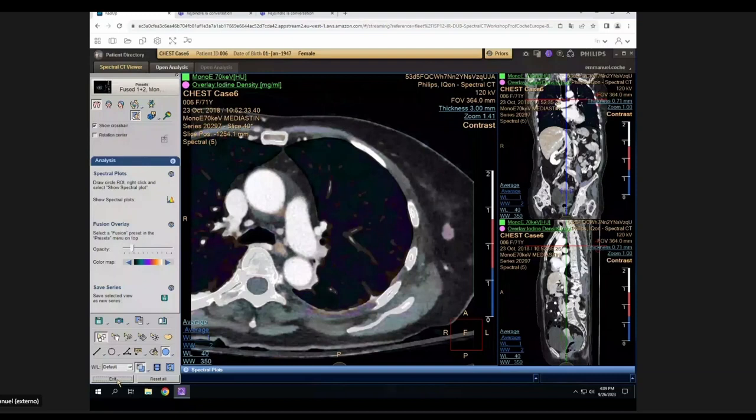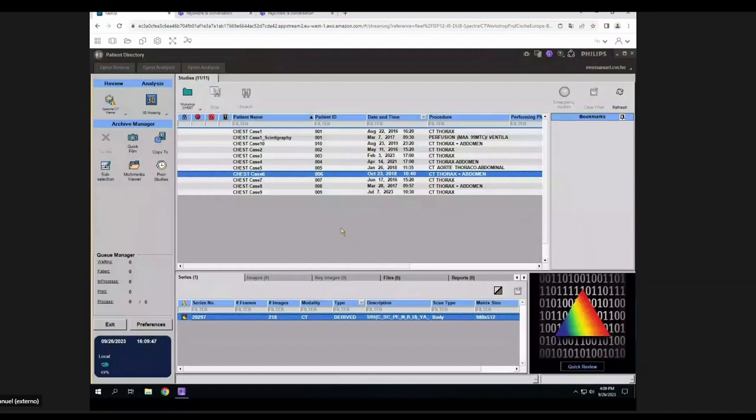There's a question I would like to ask Professor Koch: if he is exploring the use of calcium suppression or even the EDW percentage maps in some kind of cases, such as the vertebral osteolysis he has just shown. It's quite difficult. We try to do calcium suppression in some cases. Sometimes we have a nice illustration of bone marrow replacement by a soft tissue.